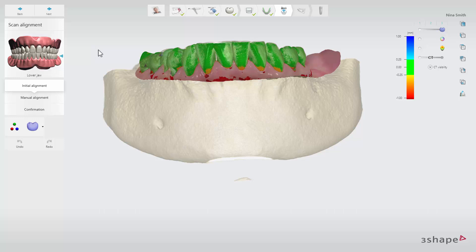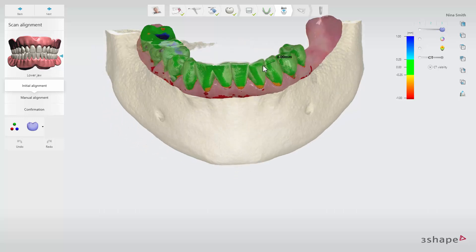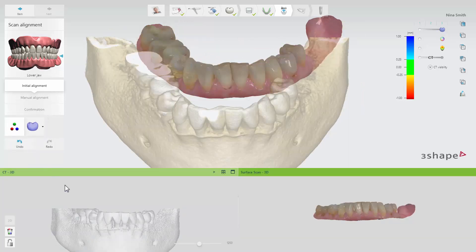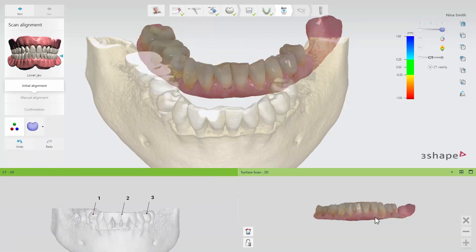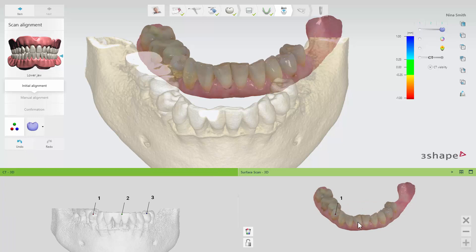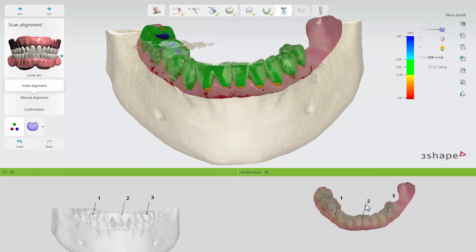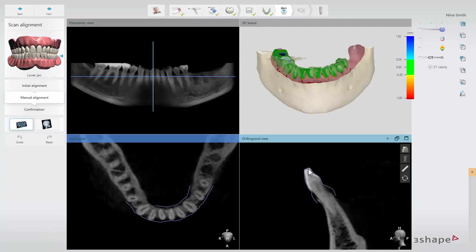You can check the alignment using the difference map that is enabled by default. You can always adjust the initial alignment by using the three-point alignment instead, or you can adjust the alignment manually.